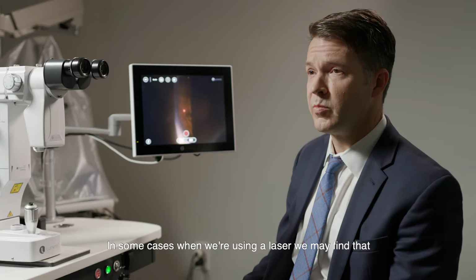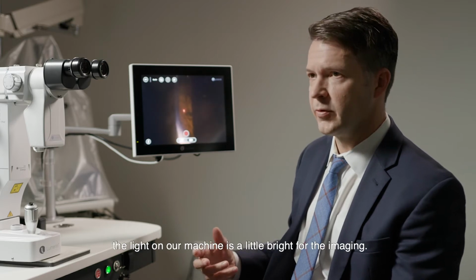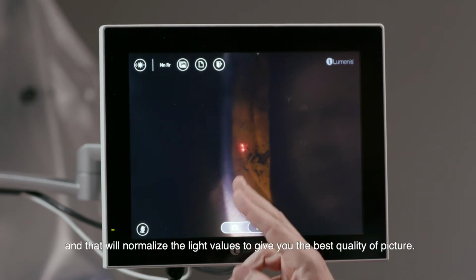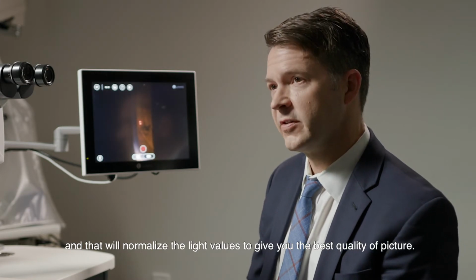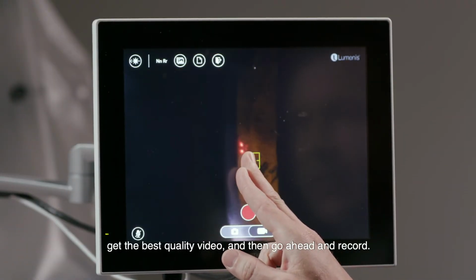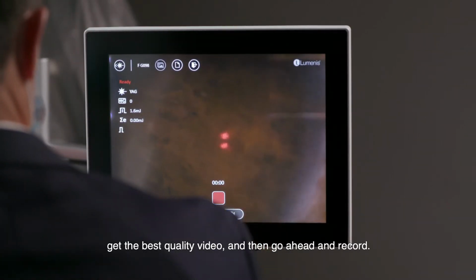In some cases, when we're using a laser, we may find that the light on our machine is a little bright for the imaging. This can all be corrected here by just pressing and holding, and that will normalize the light values to give you the best quality of picture. So if you're about to film something, you notice it's a little dark, you can go ahead and just make the adjustment, get the best quality video, and then go ahead and record.